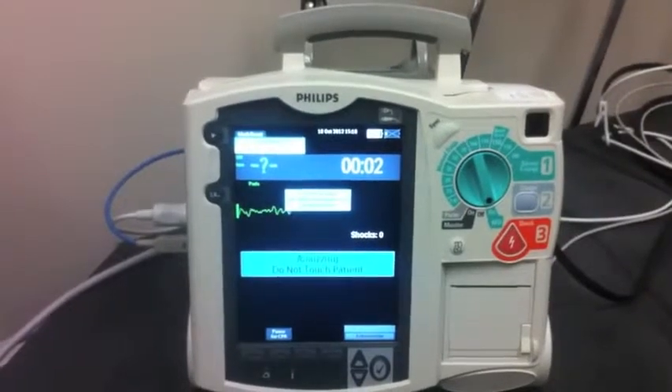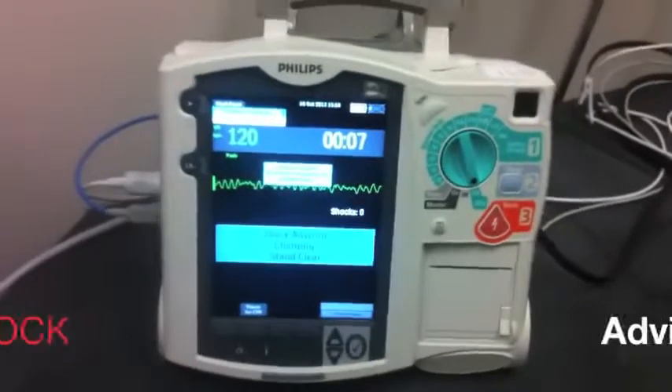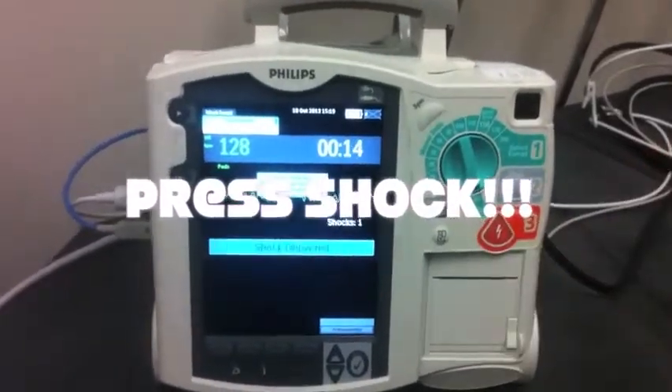Analyzing heart rhythm. Do not touch the patient. Shock advised. Stay clear of patient. Deliver shock now — press the shock button. Shock delivered.